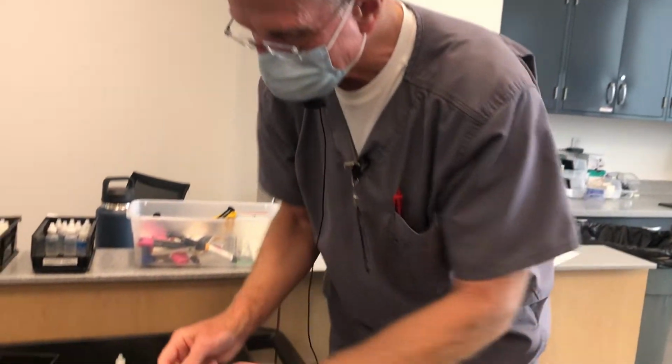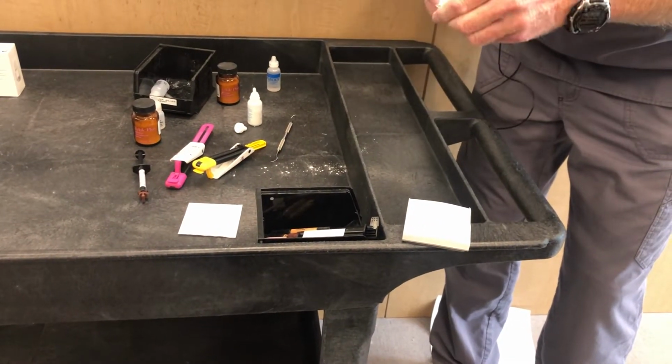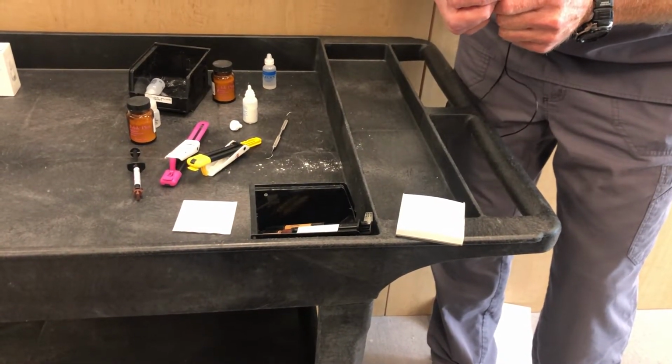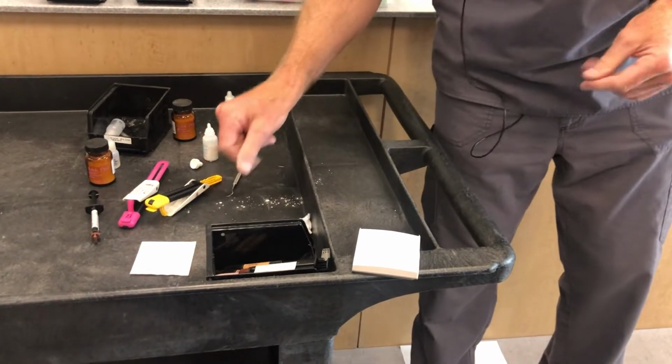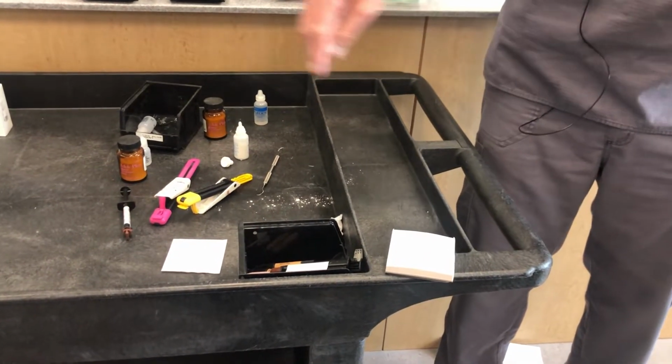So let's do a second mix there. And again, make sure that your assistants mix for a full 20 seconds on this. Sometimes you'll get both base and catalyst fully incorporated. Would somebody wash that off with a little water, get the rest of that off with a fingernail. The streakiness, the materials have a little different color out of the two barrels. The streakiness can be gone in 10 to 15 seconds easily. But if they haven't mixed it quickly and thoroughly, that whole 20 seconds, sometimes you don't get complete polymerization. So you definitely want to agitate it well, mix it well, 20 plus seconds. Don't go too long over that or you'll start to set on you.